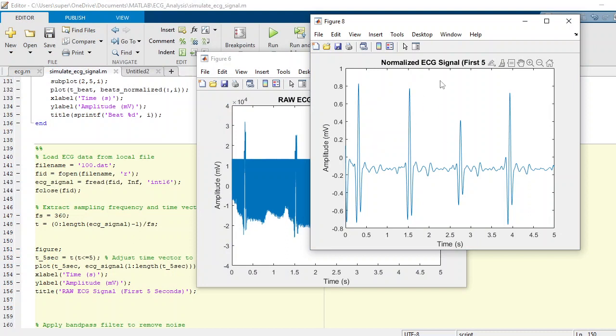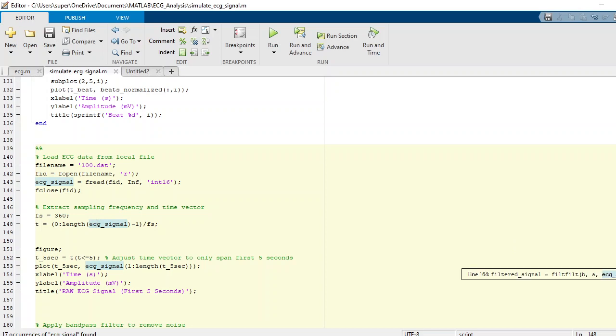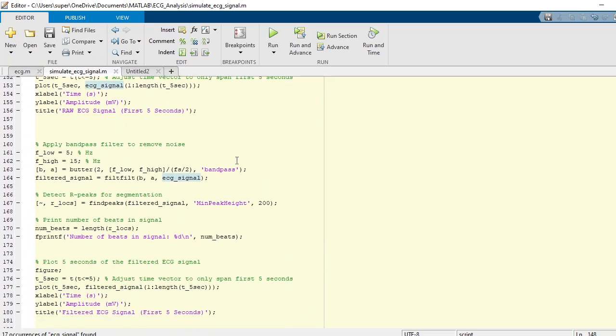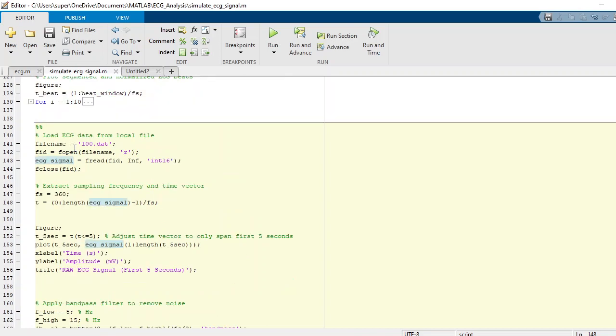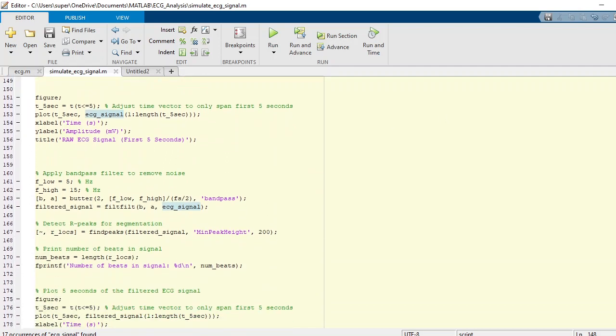Coming back to the code, what we do next is we apply a bandpass filter. What the bandpass filter does is it basically removes the noise in our ECG signals.